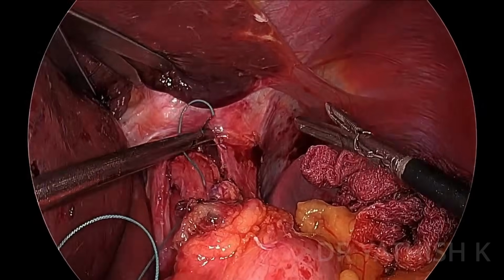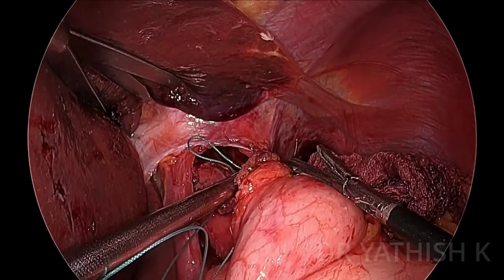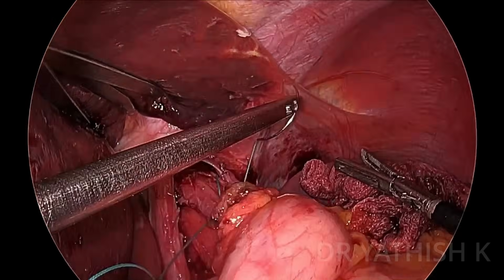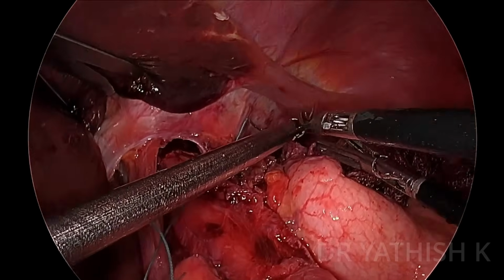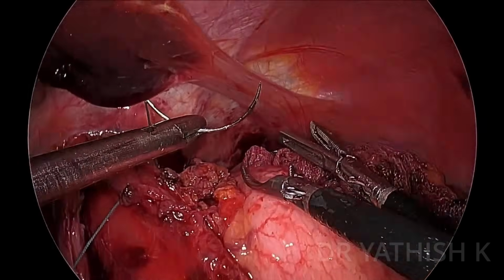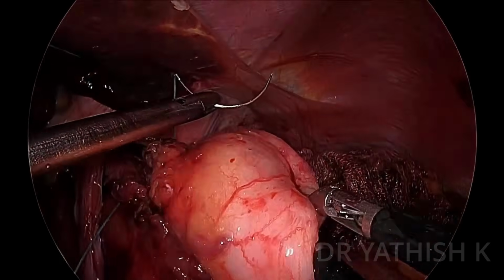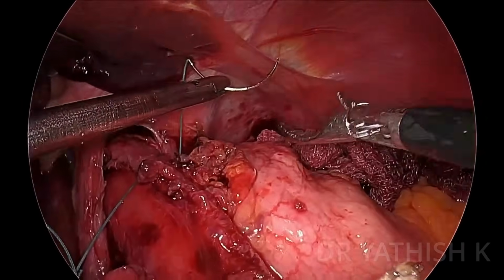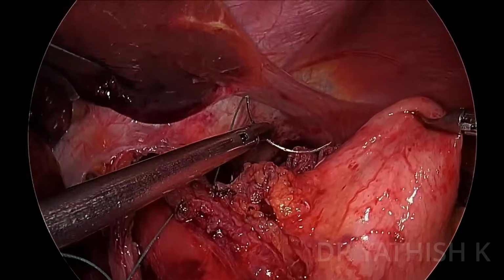So carefully observe here. I'm first taking a bite on the esophageal musculature on the left side, then on the left crus. Then you see I'm going to take a bite on the anterior surface of the fundus, which is close to the angle of His. I'll come back to you on why creating a wrap in this manner is important.